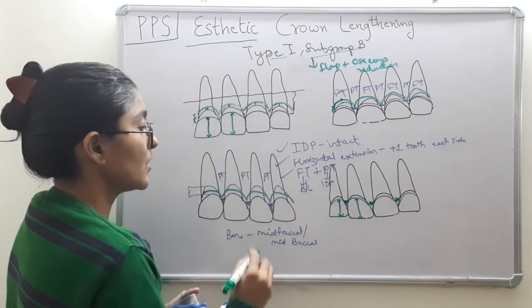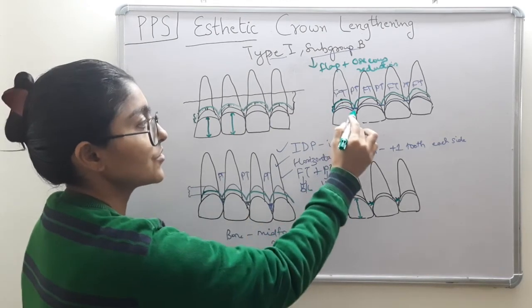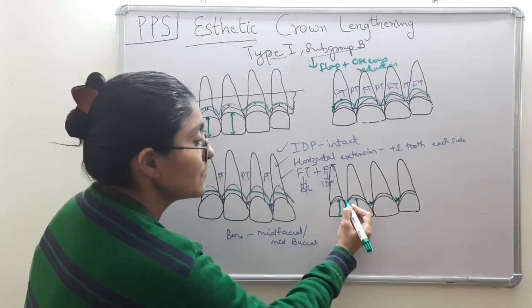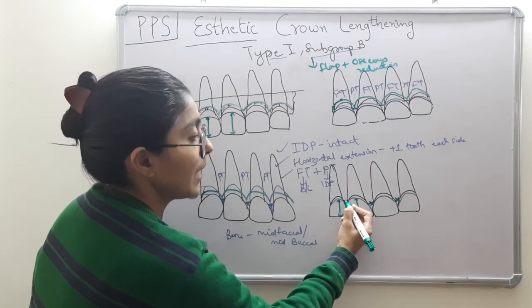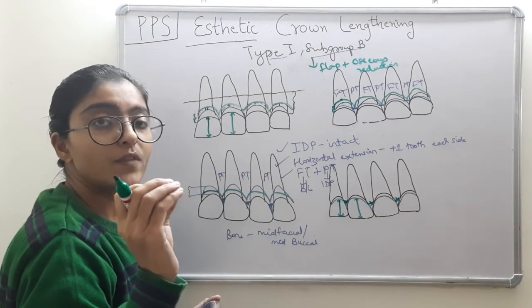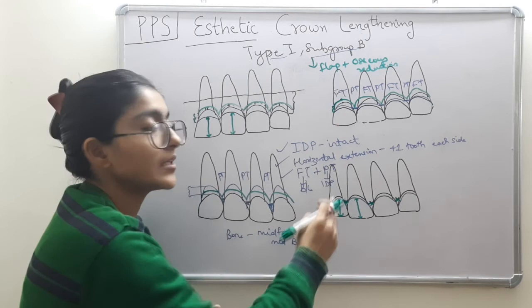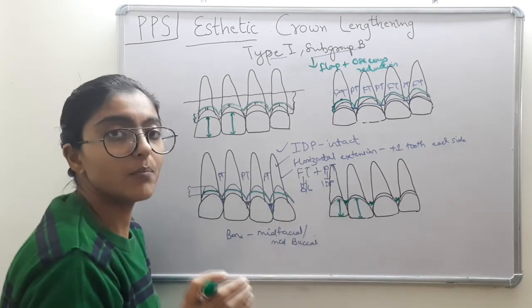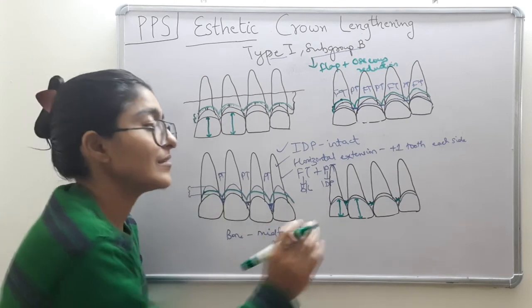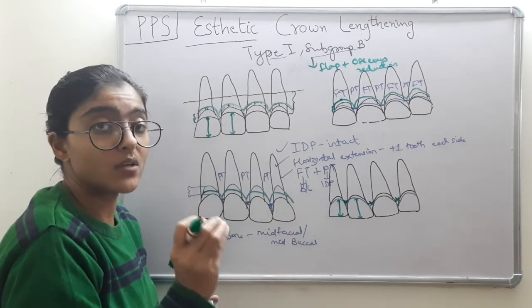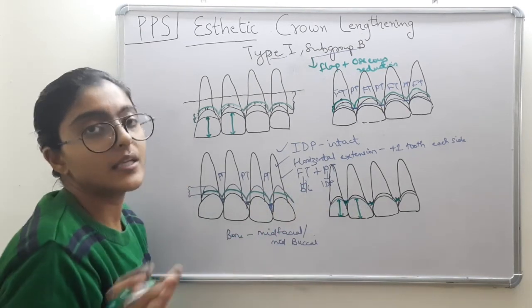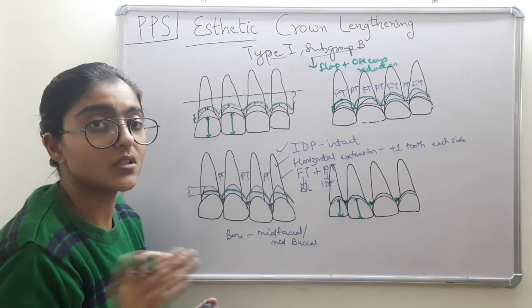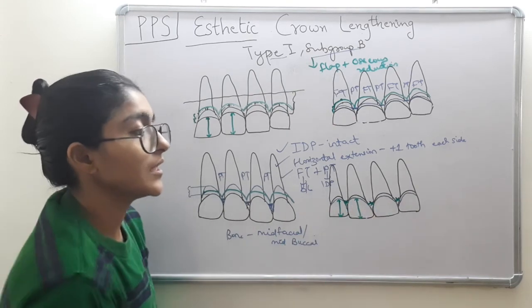One important point: since we gave an internal bevel incision, some portion of the flap is marginally resected. The partial-thickness flap in the interdental area may tend to remain slightly exposed, so the suturing technique must ensure proper approximation of the partial-thickness flap with the intact interdental papilla. After crown lengthening, ensure there are hardly any exposed regions. The crown has now lengthened appreciably.